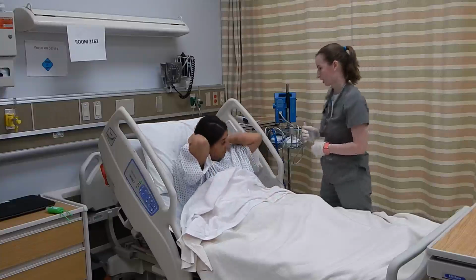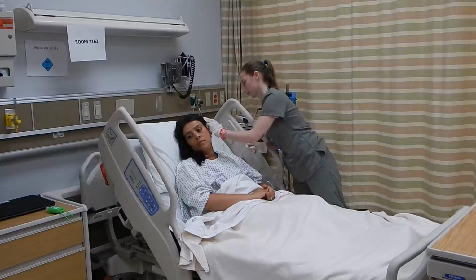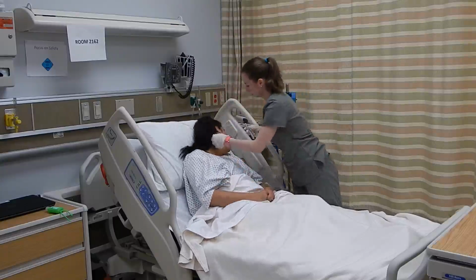Inspect ear canal and tympanic membrane. Mind if I look into your ear canal? Tip the client's head away from you and straighten the ear canal by pulling the pinna up and back. Normal findings are pearly gray in color and semi-transparent.